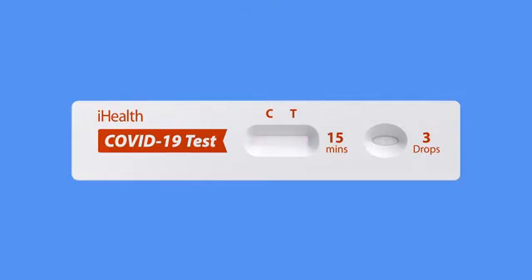If no line appears under the C, then the test card is defective, and, if possible, you will need to test 3 drops of your sample on another card. The T line is the test line. A line will only appear under the T if you have tested positive for the virus. If there is no line under the T, then the test did not detect any virus in your sample.